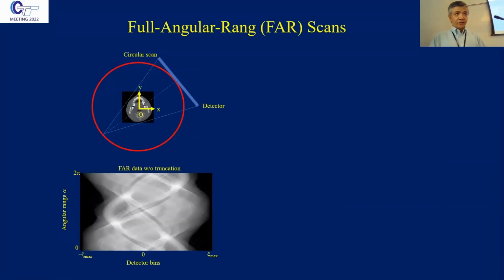This is an image everybody is probably familiar with. Suppose you have a cone beam or fan beam. Then at the bottom is the data space. I use the fan beam case just as an example; your cone beam with an arbitrary trajectory is fine.